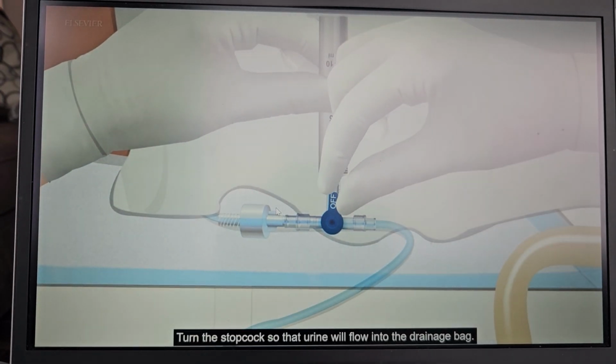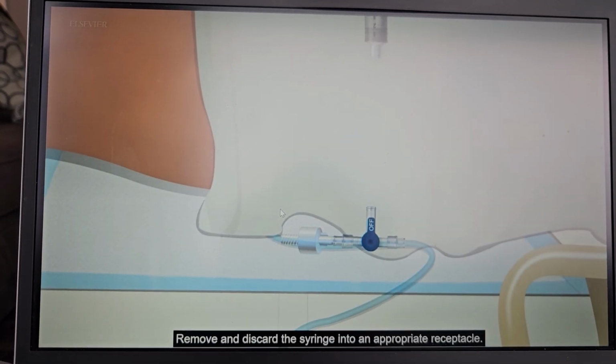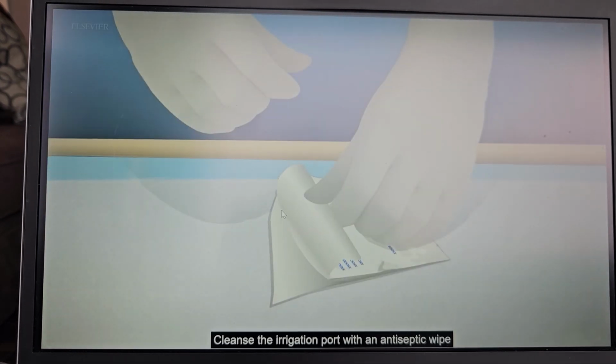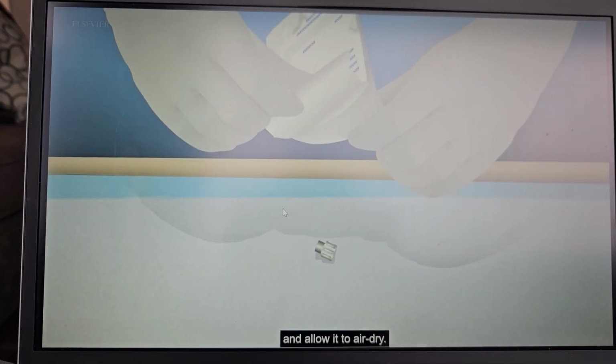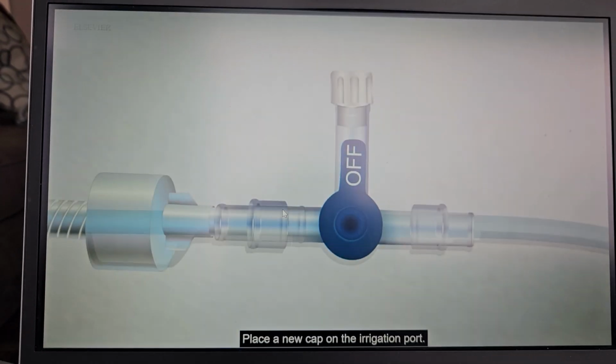Turn the stopcock so that urine will flow into the drainage bag. Remove and discard the syringe into an appropriate receptacle. Cleanse the irrigation port with an antiseptic wipe and allow it to air dry. Place a new cap on the irrigation port.